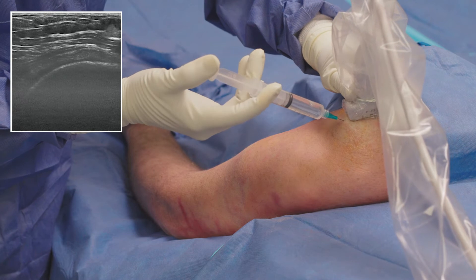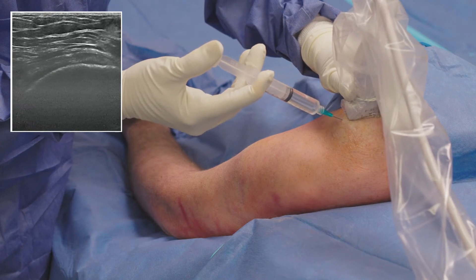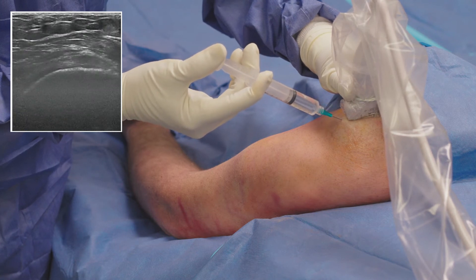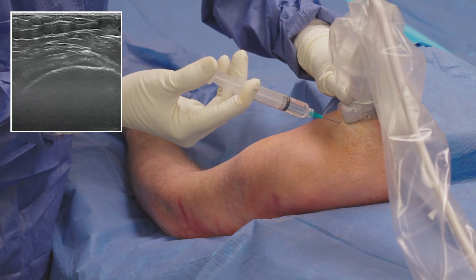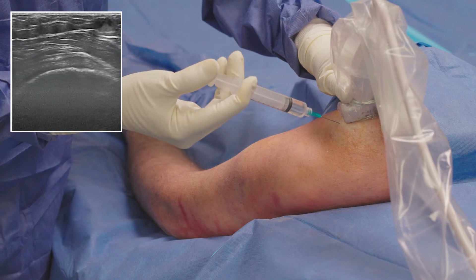To ensure that the patient has minimal discomfort during the procedure, I administer a local anesthetic to the affected area using an inline parallel approach. I use ultrasound to guide the needle to the diseased tissue and anesthetize the needle track from the supraspinatus tendon to the superficial structures.